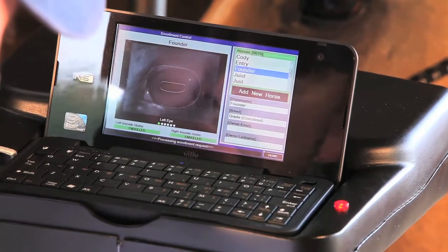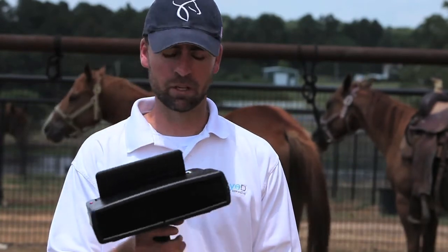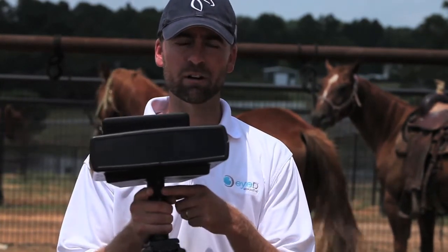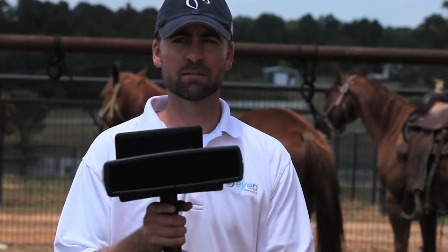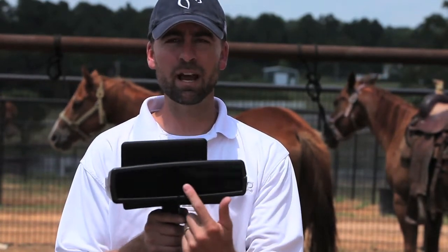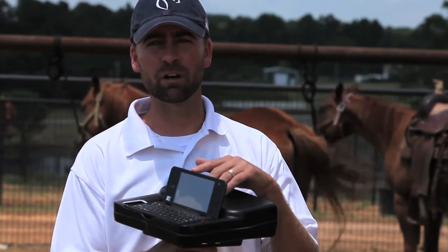So what we have here again is a field-ready prototype equine iris scanner for the purpose of equine identification. We have in this housing 2 infrared illuminators and a camera which acquires the iris image used for the identification purposes. We also have a handle here that has a trigger that allows us to start and stop the video capture process. We also have a power supply on the bottom of the camera that supplies the power to the infrared illuminators, the camera, and as well the onboard camera that we have here that is running the software used to capture the images.